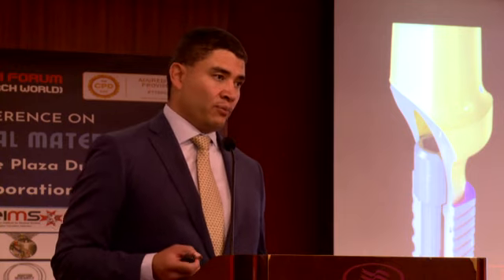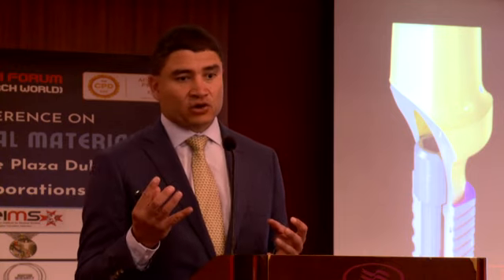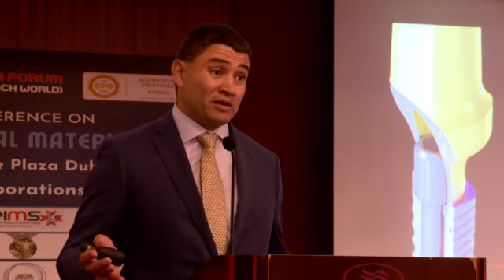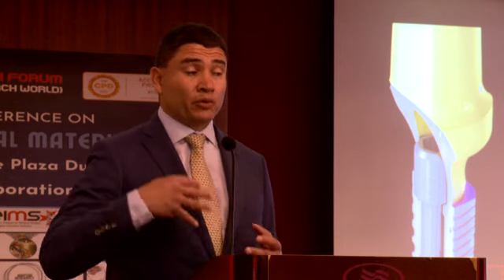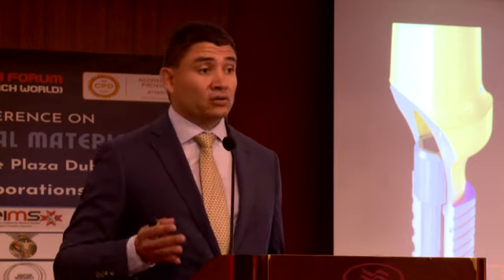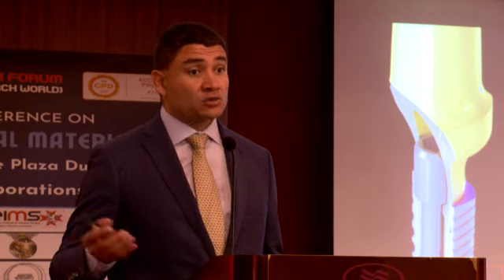Now, the implant thread design. Oh, I use an implant that has a very aggressive thread design because it engages and gives me primary stability. So what? It's just primary stability. Once the metabolic processes of bone physiology happen, that primary stability doesn't really matter, because you get to the secondary stability, and that's what Ragavendra has shown in the ITI consensus that you mentioned this morning, right?